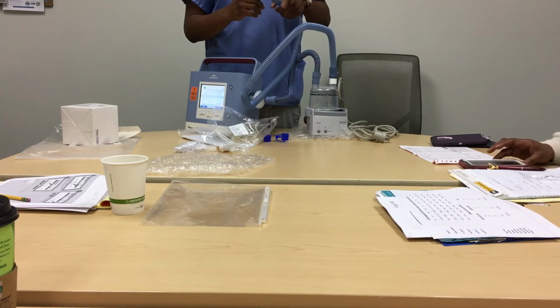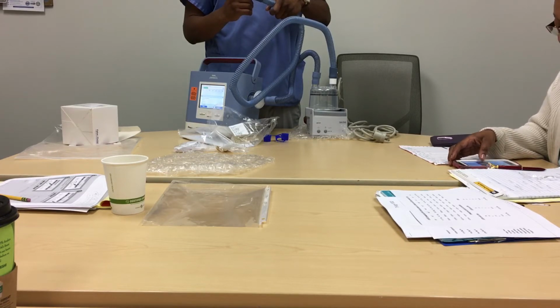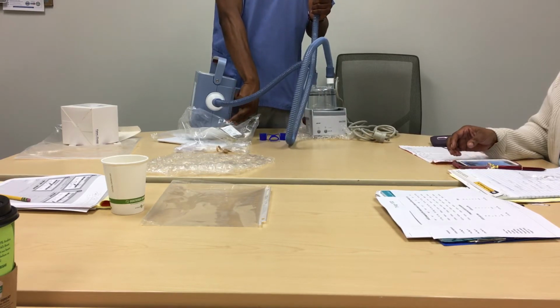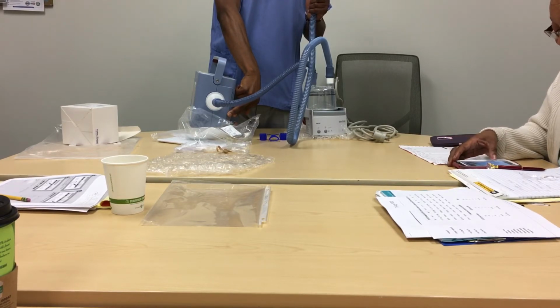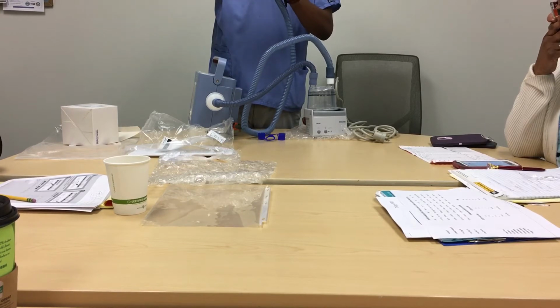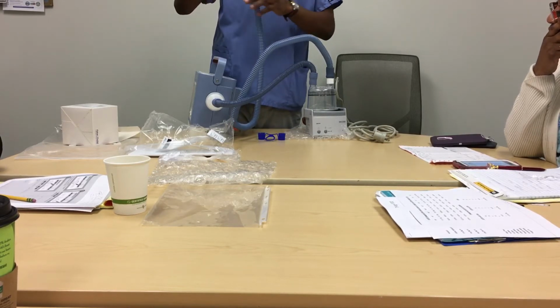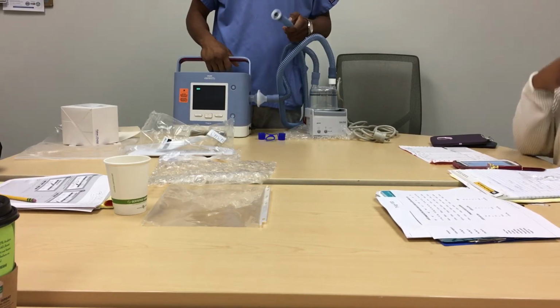Yes, ma'am. On the invasive, there really is no exhalation port. There will be one that you connect right here. If they are on a passive circuit, you use the swivel connector, because that will work with the exhalatory mechanism. If they are on an active circuit, you have to have the pressure port. Okay, yeah, thank you. Good to know.